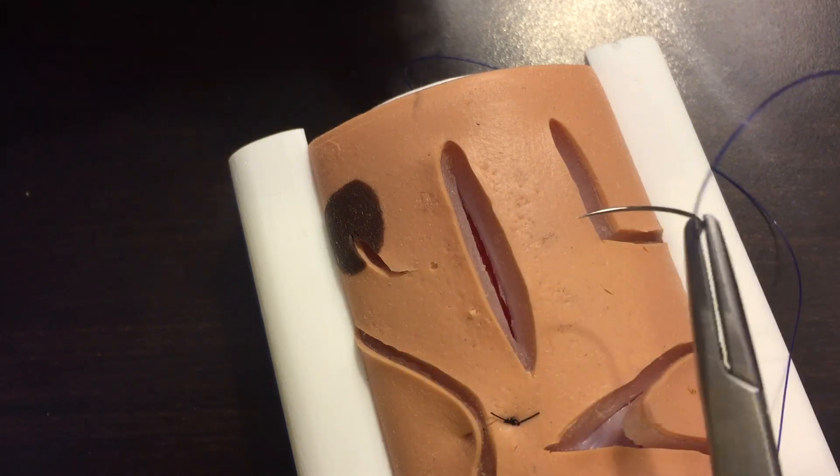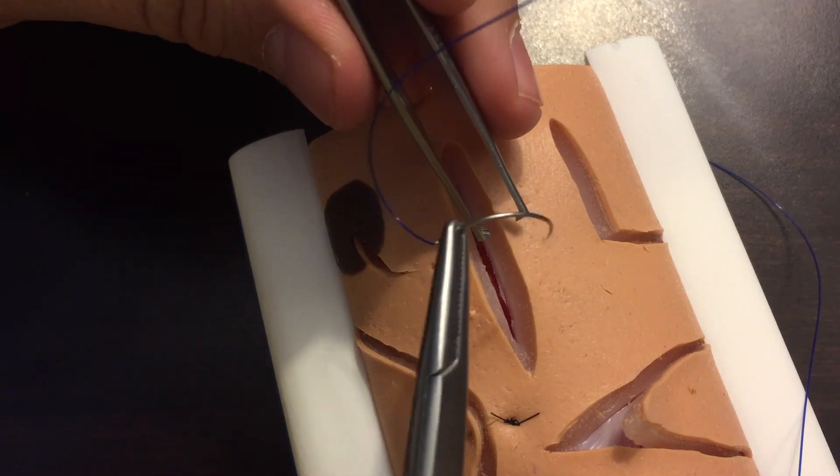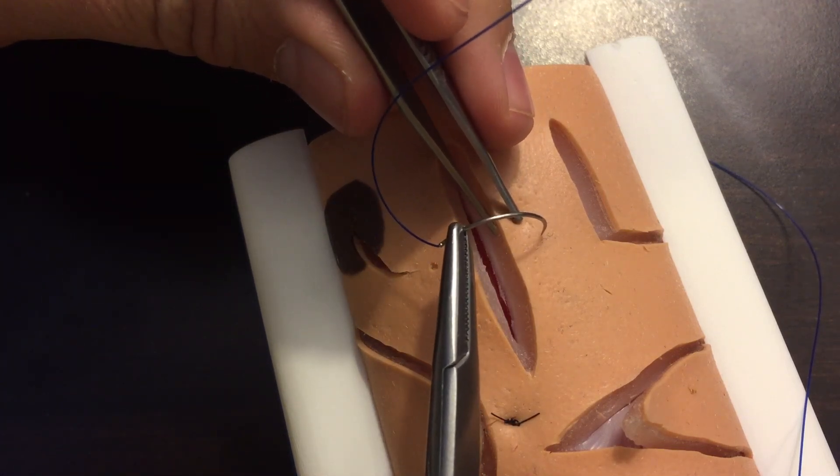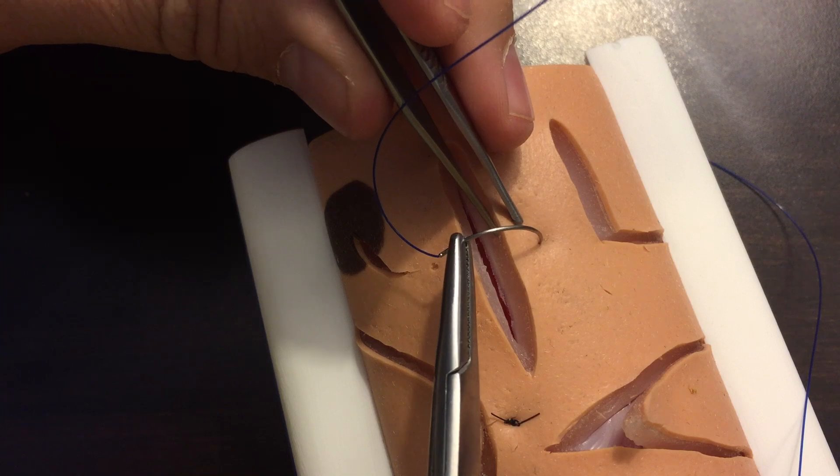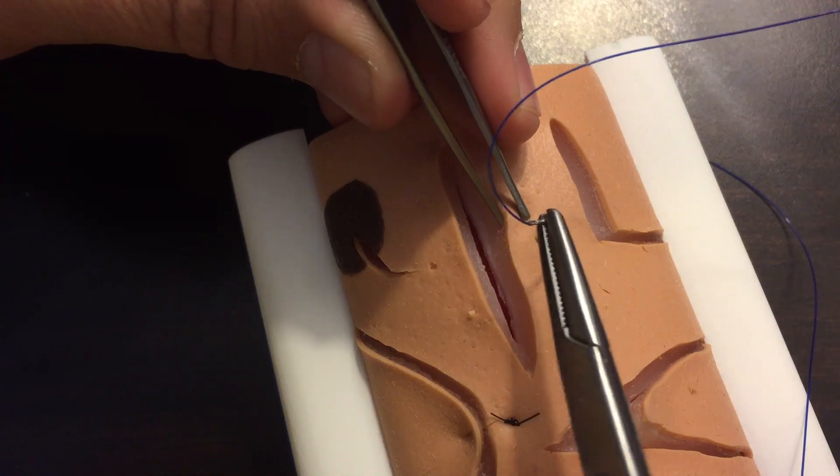Rather than trying to explain it, let me just demonstrate and I'll explain as we go. We're going to enter the skin at 90 degrees as we always do, so rotate your needle driver in a way that allows your needle to enter at 90 degrees.